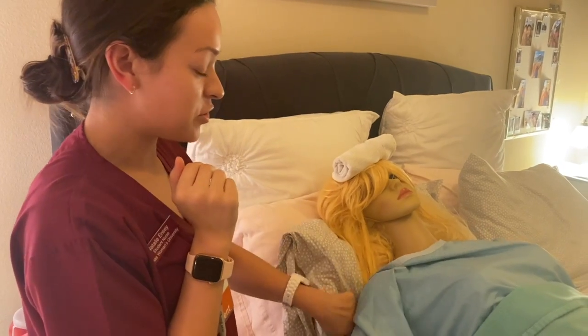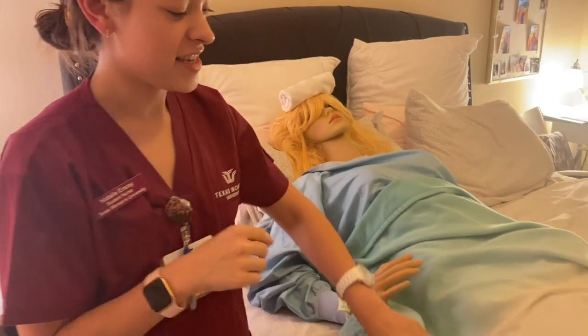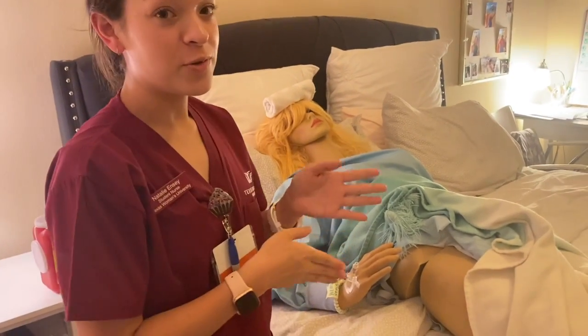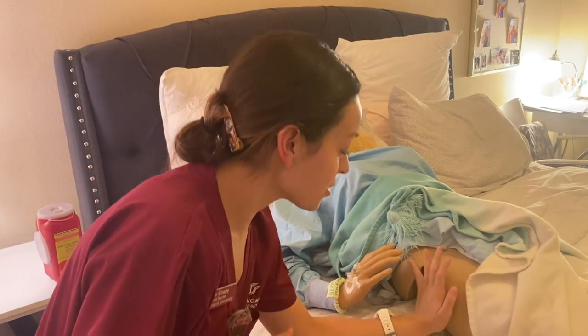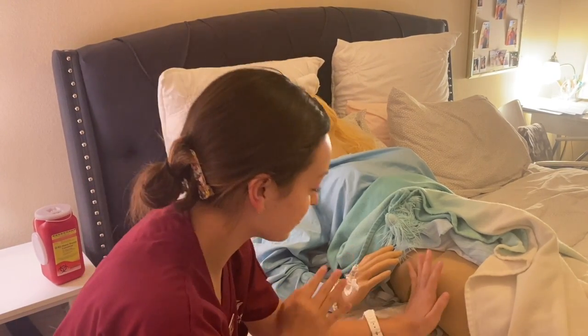Next, I'm going to demonstrate the ventrogluteal site, and I'm just going to lift my patient's gown. And first, since this is her right hip, I'll be using my left palm to put it on her greater trochanter. So it would be around right here, but she's a little dissembled.